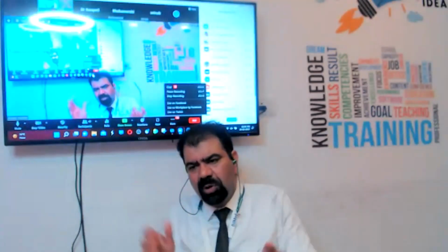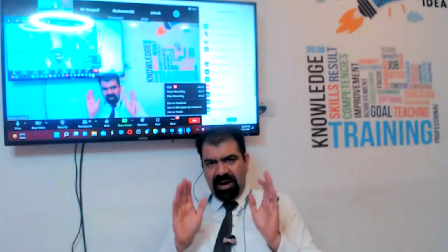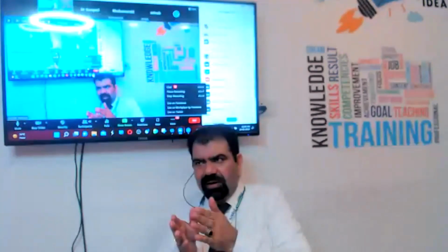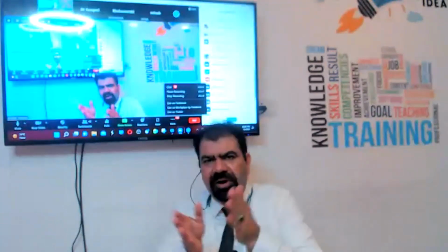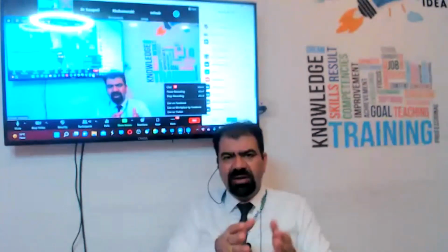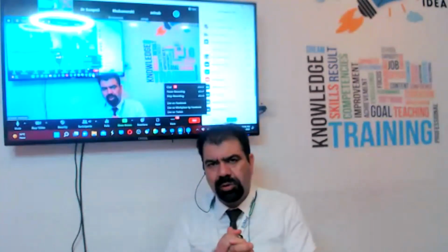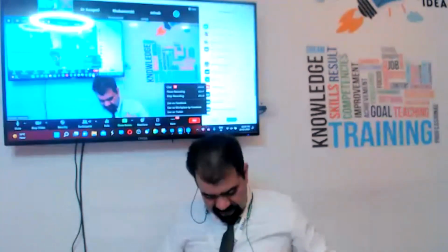I will sum up your question and you will tell me whether I have got it right or not. Sometimes you are seeing a thickened endometrium and you are getting confused with something in the endometrium, and that something may be a blood clot over there. Yes or no? Yes, sir.